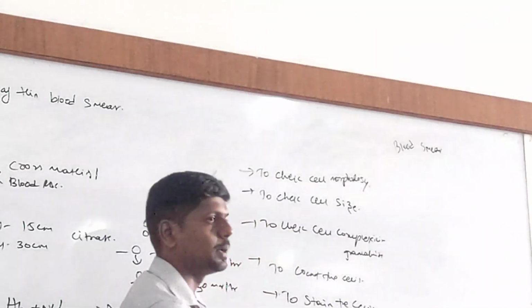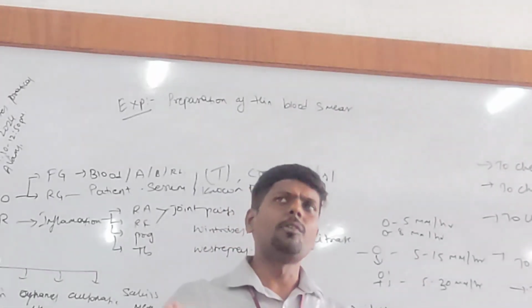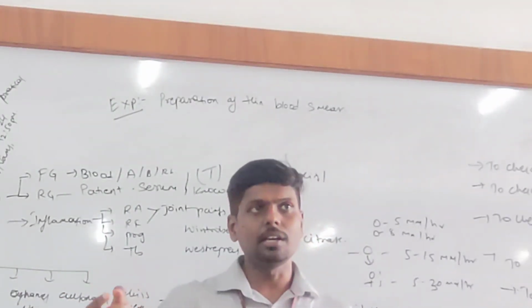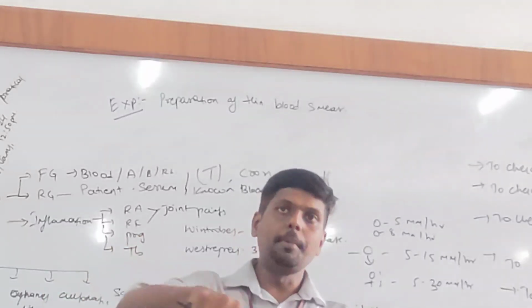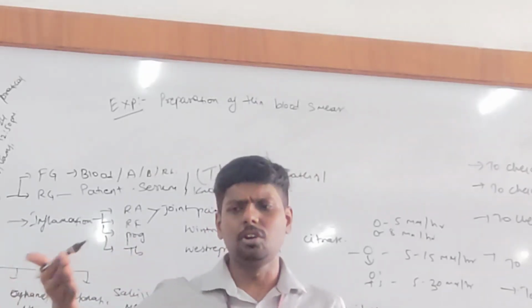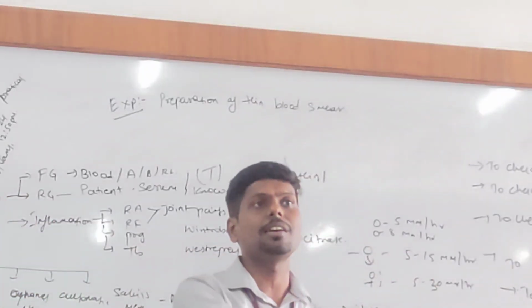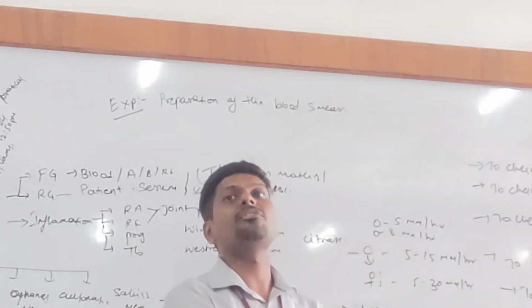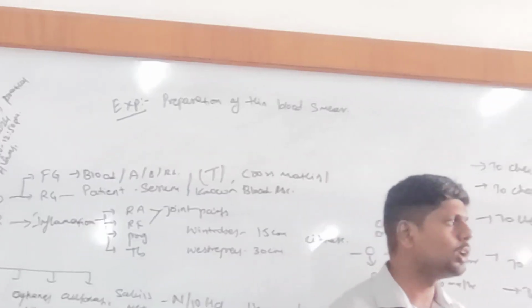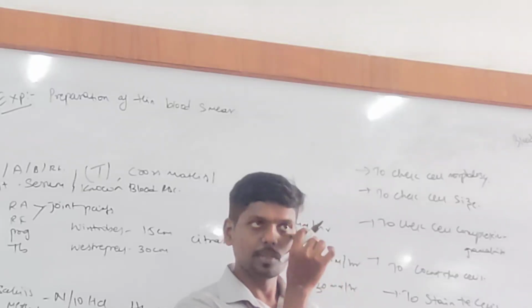For preservation purpose. When I say preservation, I mean that today one patient has leukemia, a blood cancer, and they will have some specific abnormal cancer white blood cells. So I made a smear, and this smear can be preserved because this cancer treatment will go on for the next 6 months. After 6 months, I will take his smear again and cross check the before-treatment smear with the after-treatment smear. So the before smear is just a preserved smear. That means we can also preserve blood cells by preparing smears. That is the idea.